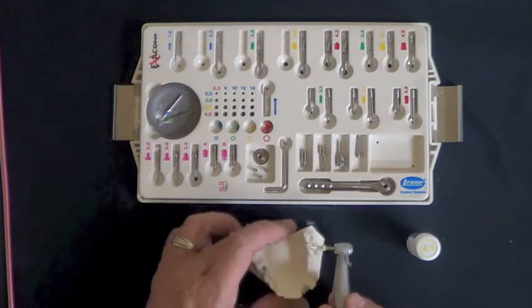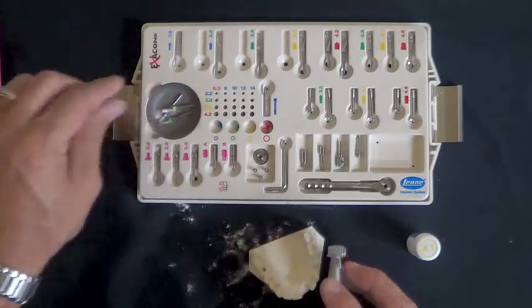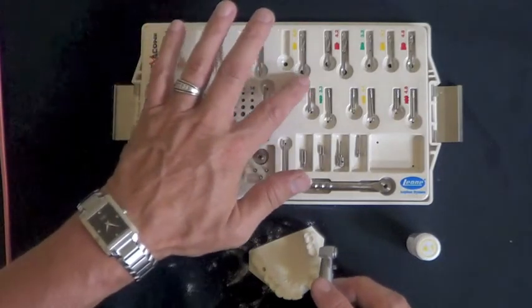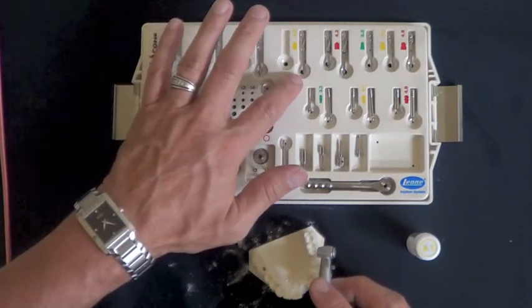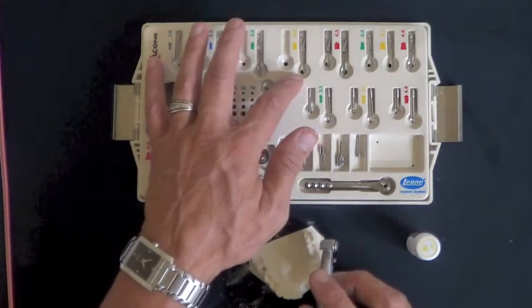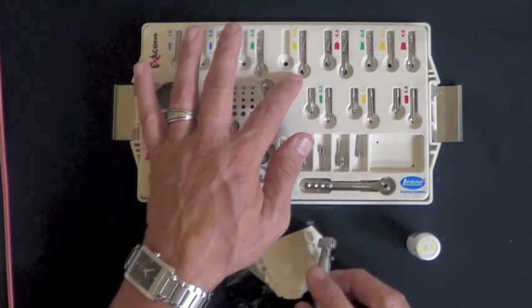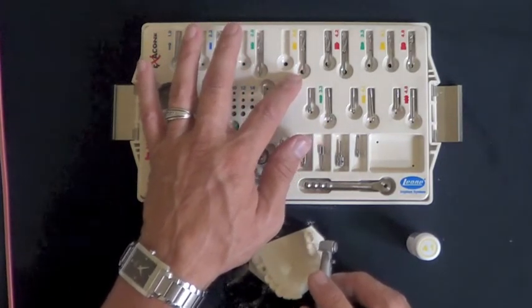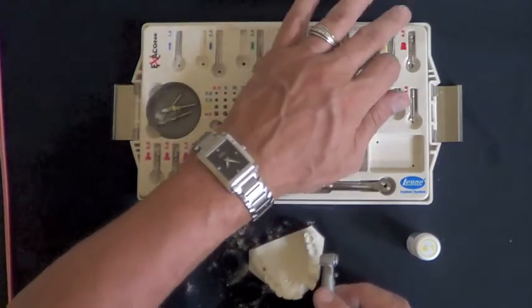All right, so once the osteotomy is done, following along from left to right, we're placing a 4.1 diameter implant, 10 millimeters in length. So the countersink that we would use is yellow in color.